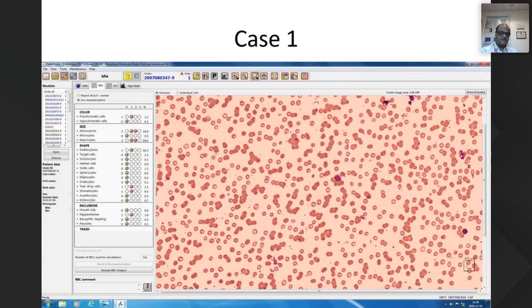See, the Cellavision gives this picture. Immediately, within 3 minutes, you can say that you have got Rouleaux formation in this. It does not have a dimorphic population as we see in our peripheral smear, but the peripheral smear of the same case confirmed that he had the Rouleaux formation. Total protein was very high, and serum protein electrophoresis was ordered for this case to understand that he had a myeloma here.